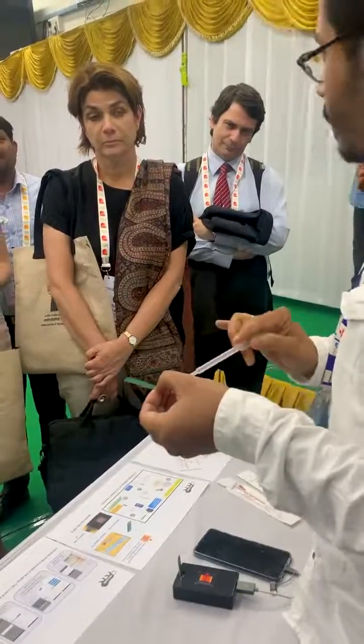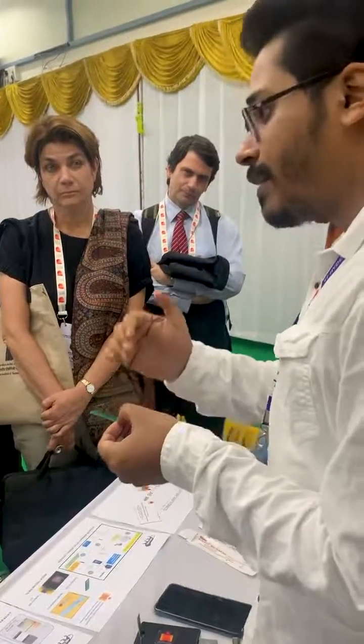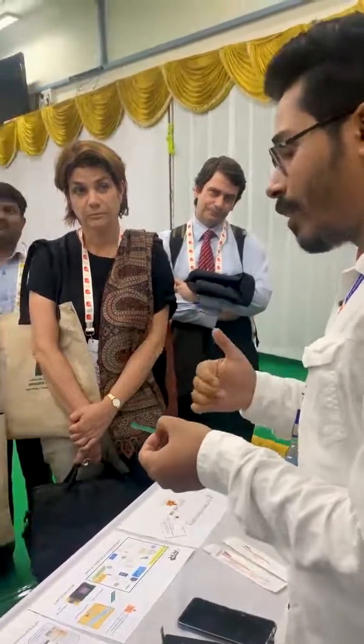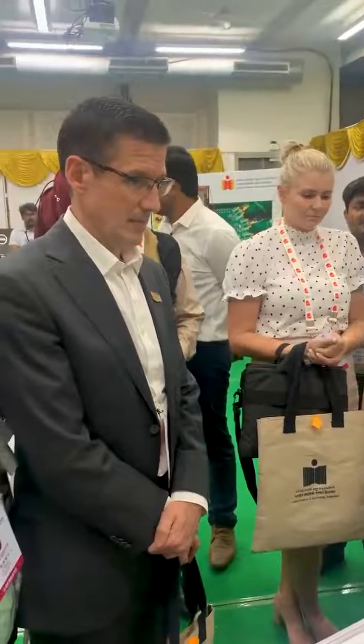So this is our sensor device. There are different designs of sensor, so based on that, multiple diseases can be checked. For example, for corona, we used 3 or 4 types of markers. So for that, 4 sensors are here. You can see 1, 2, 3, 4.